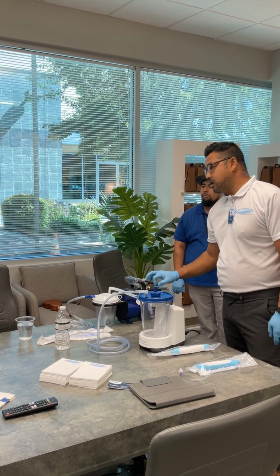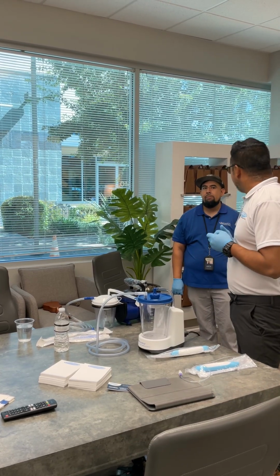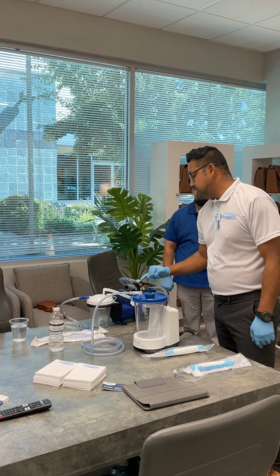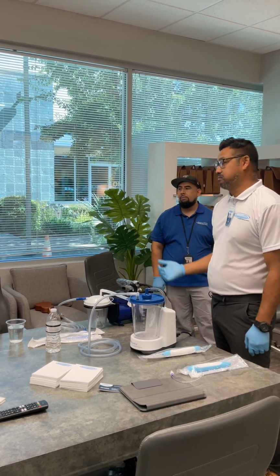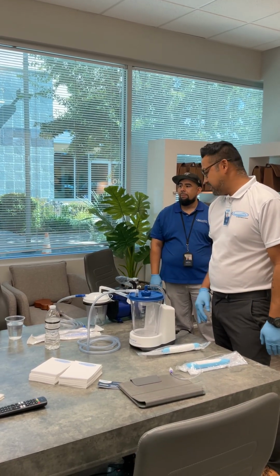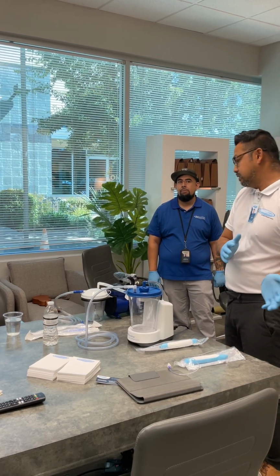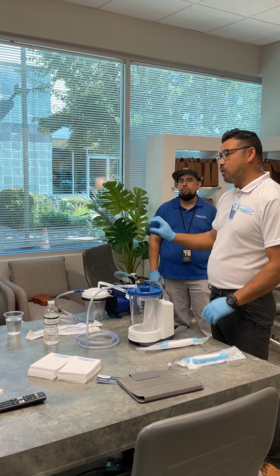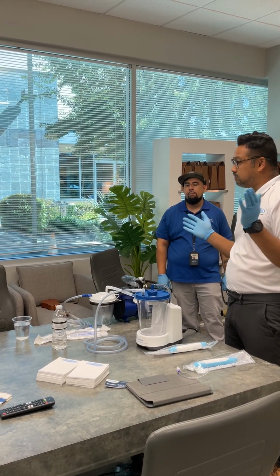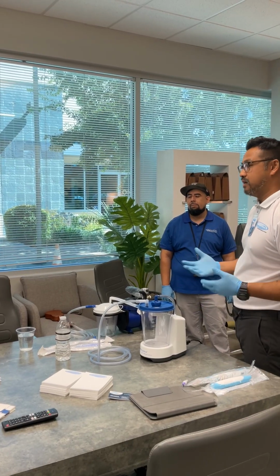Gastric suctioning is 90 mmHg, and then there's a 120. This one starts at 100 and goes all the way to 700. You'd suck their stomach out. Even at 100, it's already at the upper limits of what gastric suctioning would do. So this is oral only. Just identify oral or gastric, because it might just show up under GOMCO. It's a vendor, a manufacturer.